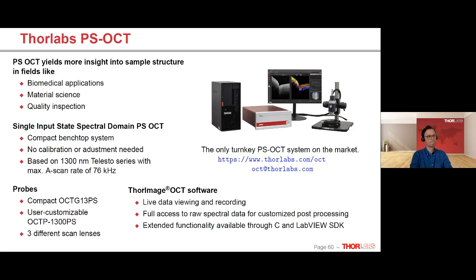Thank you. The next question, is there a reason why you use Stokes formalism and not Jones? Well, we're actually using the Jones, or they are similar in this case, because we are not making really an averaging. So we use the signals directly.